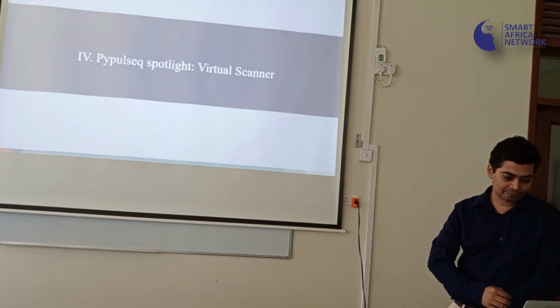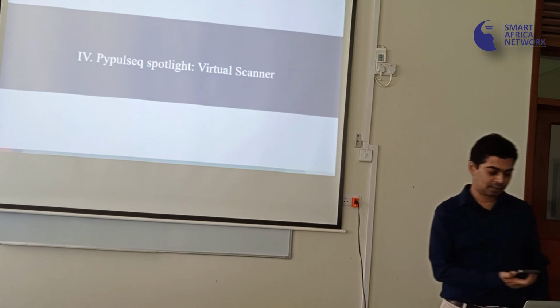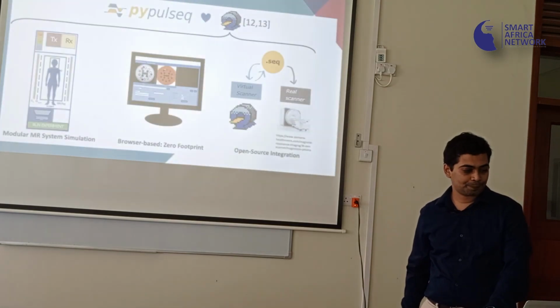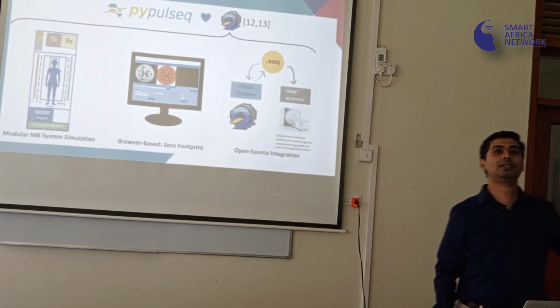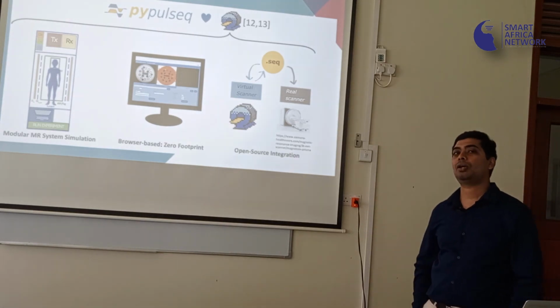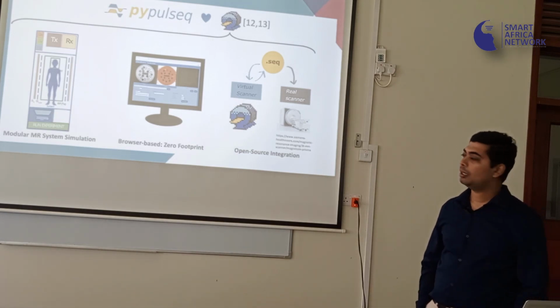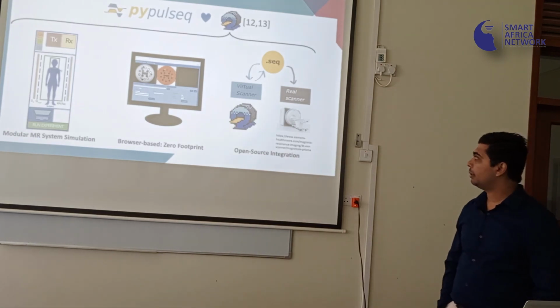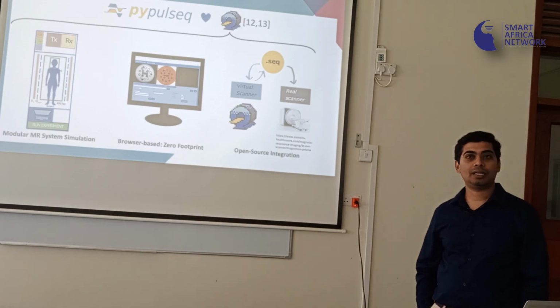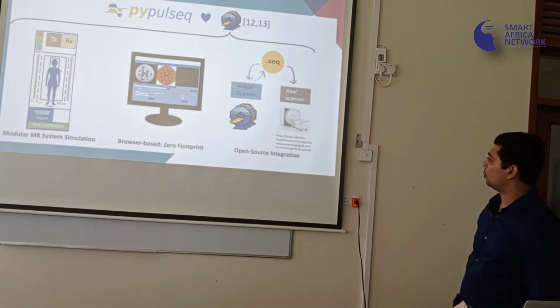The last part, I have quite a bit of slides on this virtual scanning, which I think is very relevant to this audience here. This is again on the web. You don't need to do anything. You can again launch this with pip install, or one person could launch and a whole bunch of others could access this. The idea here is, let's say you didn't have the hardware and you wanted to simulate all of this. You could do this using what we call the virtual scanner.